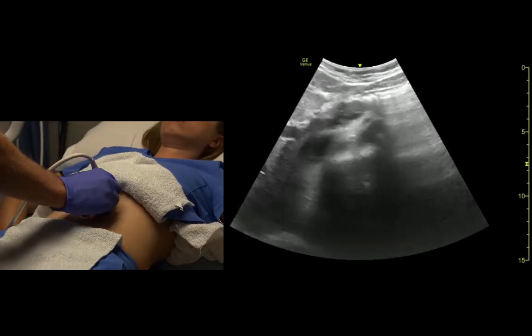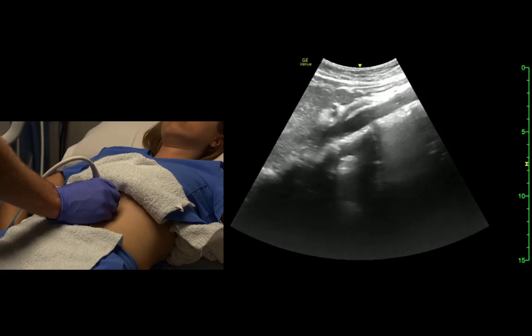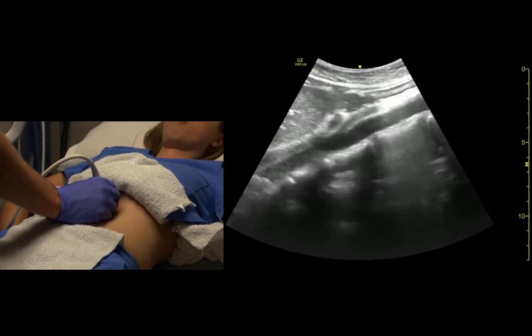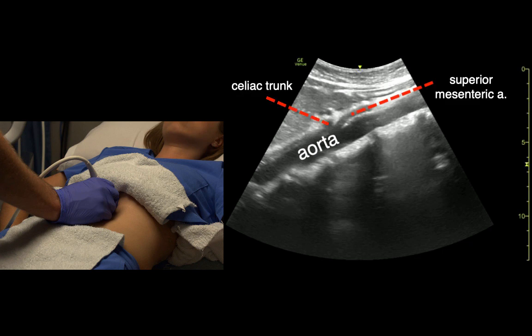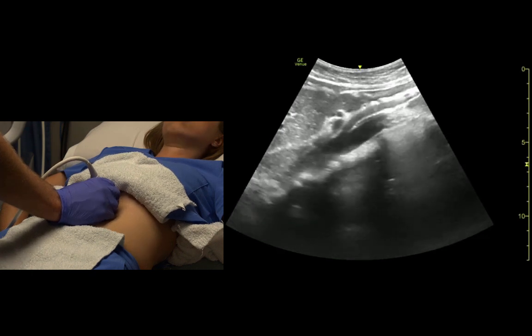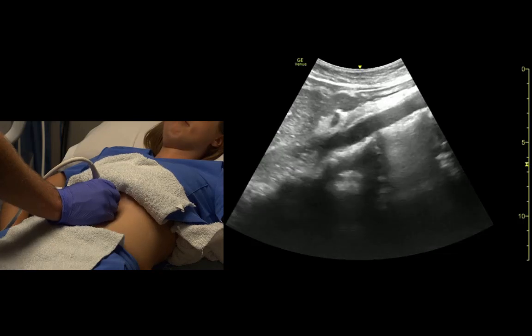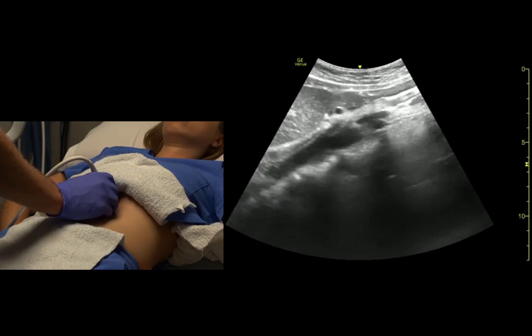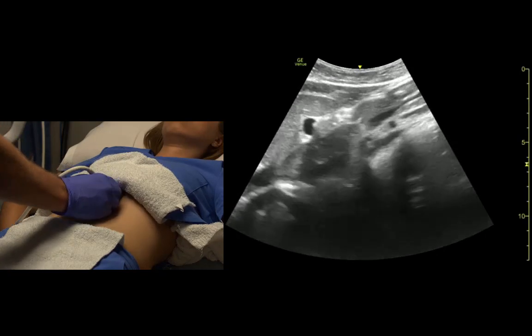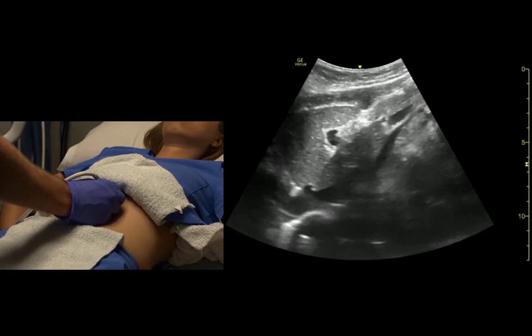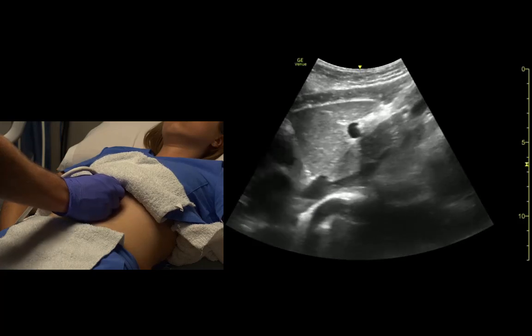Let's look at the aorta in long axis. Up high on the abdomen we see the SMA comes off and runs vertically right in front of the aorta. The celiac trunk comes off and then splits right away. And if we just fan to the patient's right a little bit and rock up towards the heart, we can see the IVC entering the right atrium.